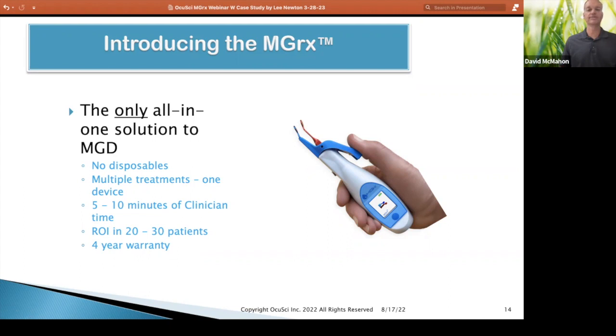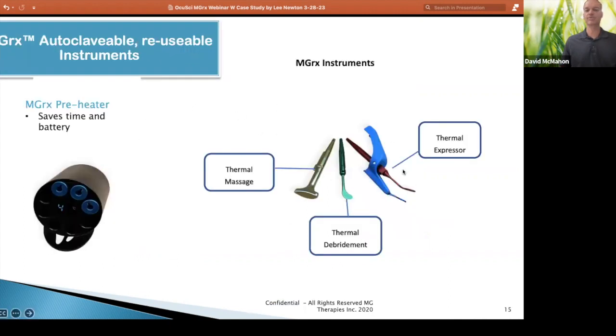Not a lot to go wrong on this device. To get familiar with the parts of the device — this is a preheater. The only purpose of that is to preheat these three different instruments that we're going to use. The handheld device is lithium-ion powered and has a heater in it. The preheater saves battery and saves your time — without it, it would take three to four minutes to heat up the instruments to the treatment temperatures of 110 to 113 degrees.